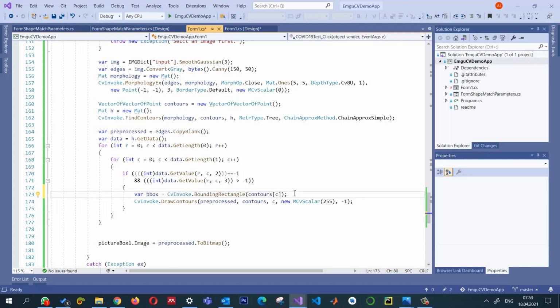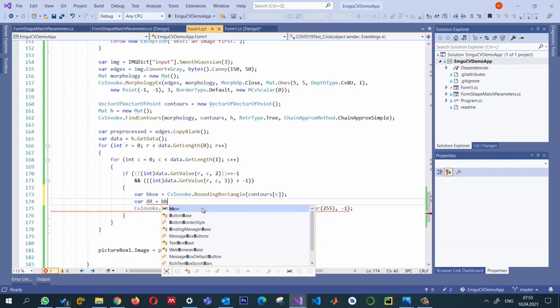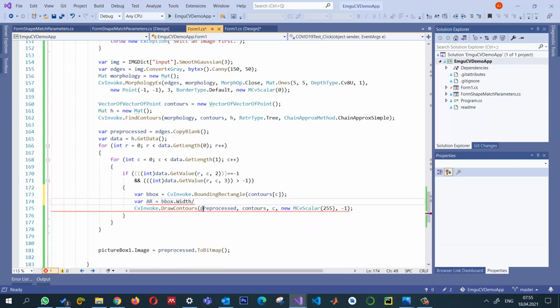And once I find this bounding box, I can find the aspect ratio. Aspect ratio is AR, we call it. Let's say AR is the ratio between width and the height. So let us calculate that, and we can find the bounding box width divided by bounding box height. And this one will be the aspect ratio. In fact, one of them should be float, since this is going to be integer if we do not do this. So when we change one of them to be a float, then the result will be a float.